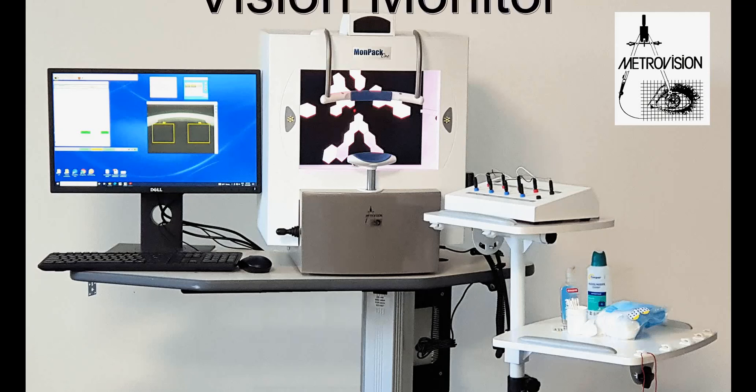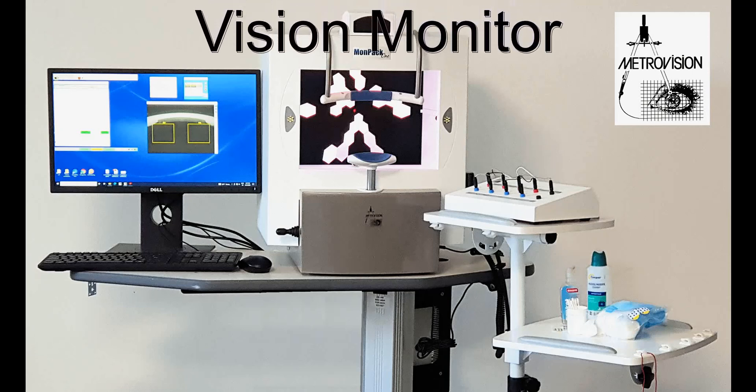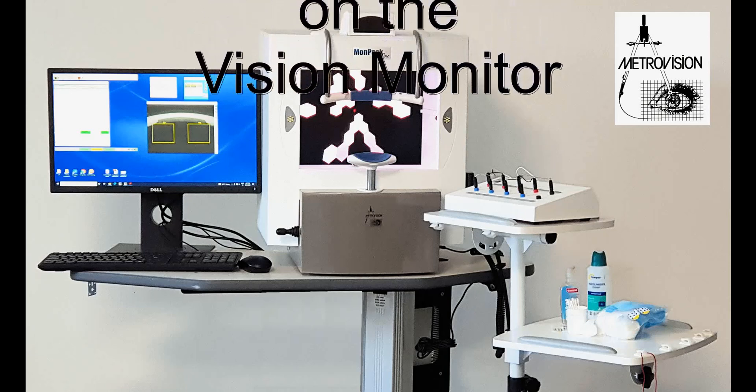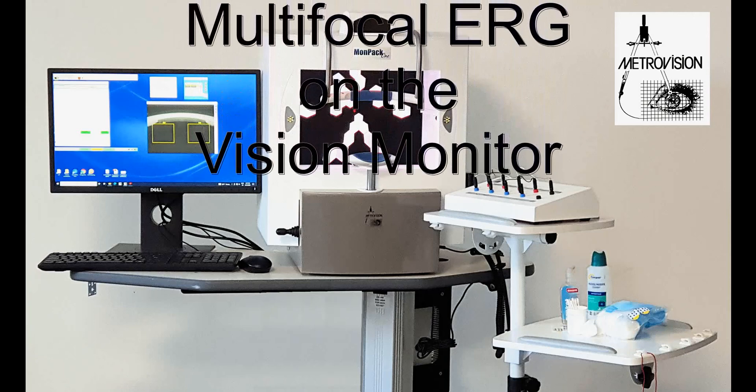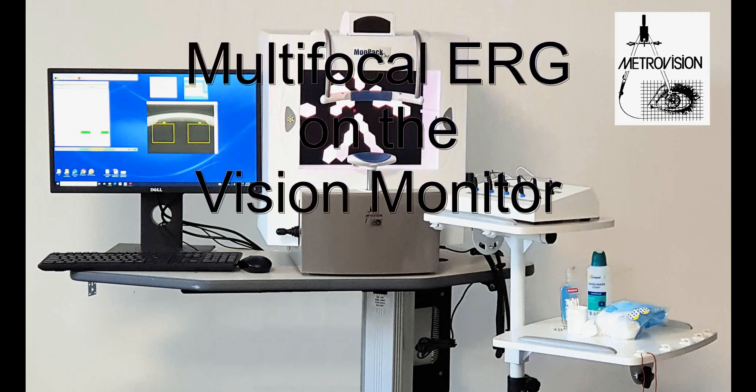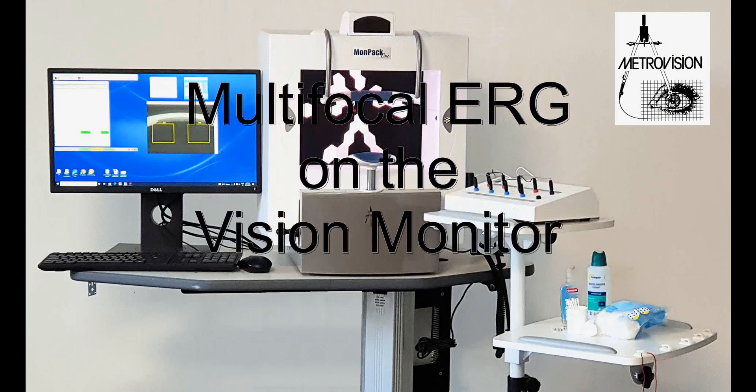Hello everybody, I would like to show you today how to realize a multifocal ERG exam on the Vision Monitor system.